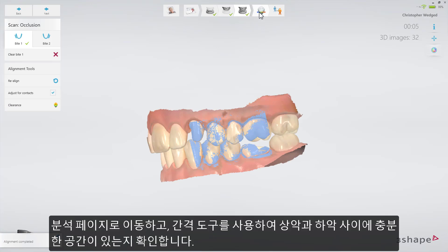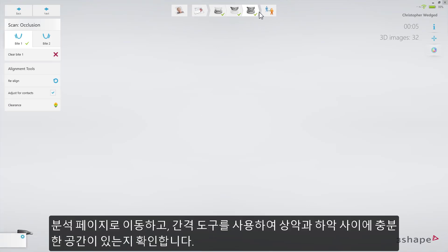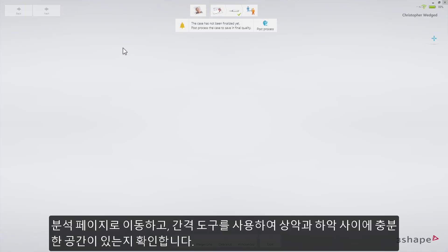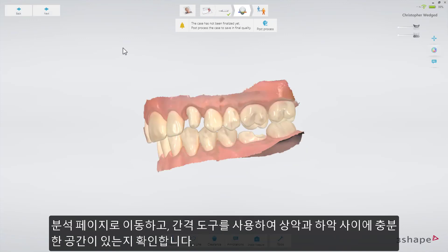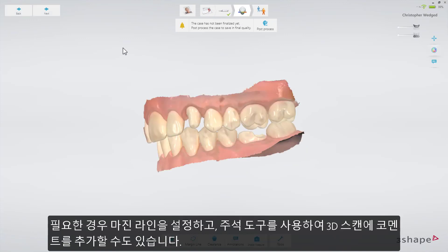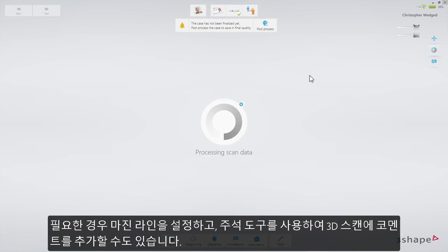Go to the analyze page and confirm that there is enough space for the reconstruction between the upper and lower jaw, using the clearance tool. Optionally, you can set the margin line. You can also add some comments on the 3D scan using the annotation tool.